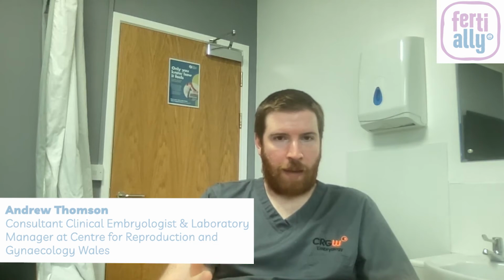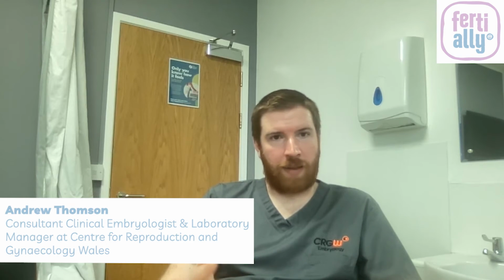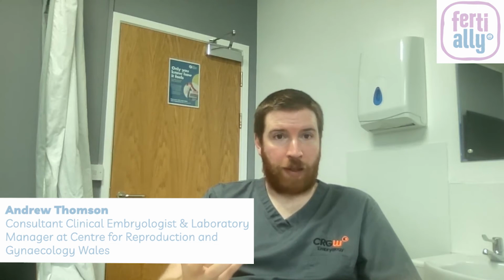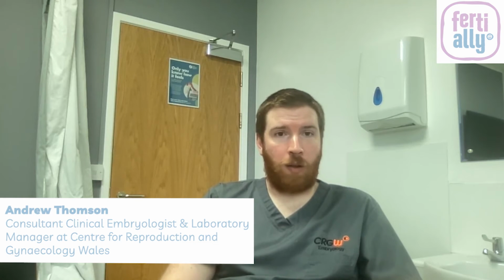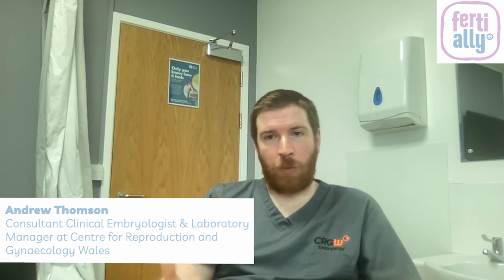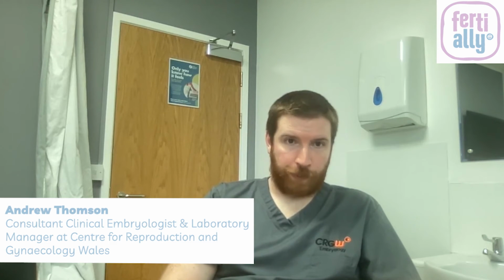The second digit is to do with a letter, which can be graded in different ways. Some clinics will do it A to C, some will do it A to E, and that is measuring the inner cell mass, which is the bit that goes on to make the baby. So an A grade would be nice, big, chunky cells that are all stuck together. Grade B would be those nice, chunky, great big cells, but they're not quite as stuck together as they'd like. A C would be smaller. In some clinics, a D will be if it's starting to break down, or an E grade would be if we can't see one full stop.